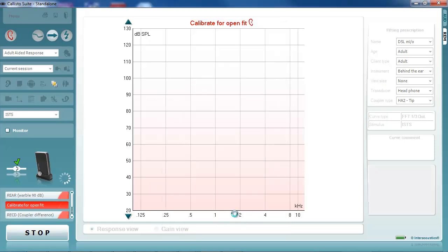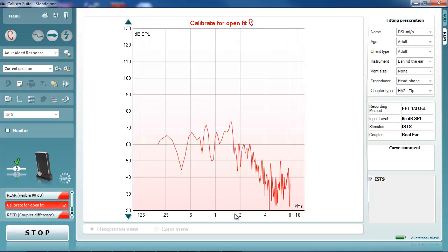A quick measurement is taken which takes into consideration the distance the reference microphone is from the speaker and calibrates the stimulus appropriately.